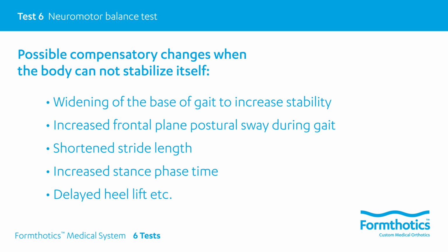Understanding and identifying if there is a difficulty in balance helps the clinician analyze the gait cycle effectively, as well as assist in the decision-making process for orthotic management. There are 3 test options for the neuromotor balance test. 1 or all 3 tests may be used.